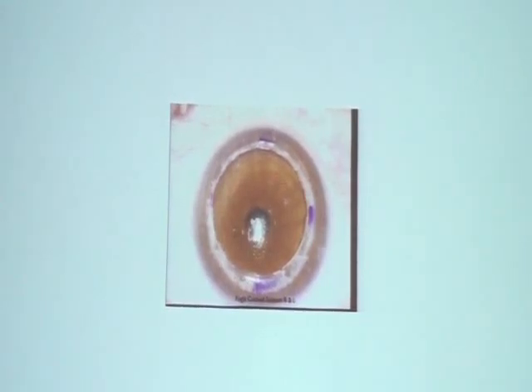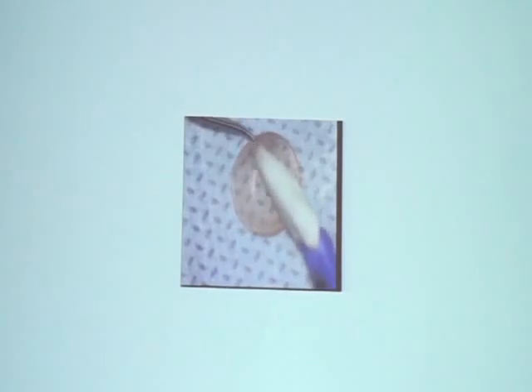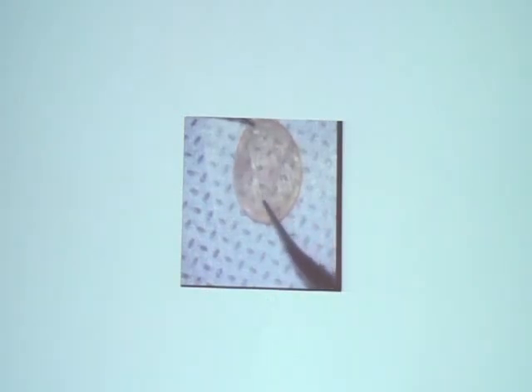So once you have removed this stroma, you see that the Descemet has a little granular appearance. It's not a very shiny appearance, and that's what Dr. Dua has shown, that there is another layer that's present there, which is composed of about 10 to 12 microns in thickness, and it's a kind of a condensation of the posterior corneal stroma.